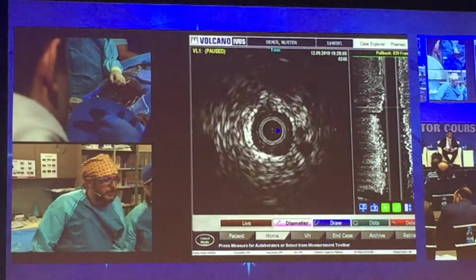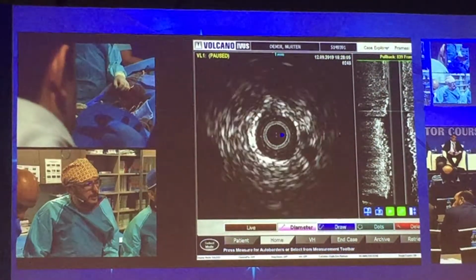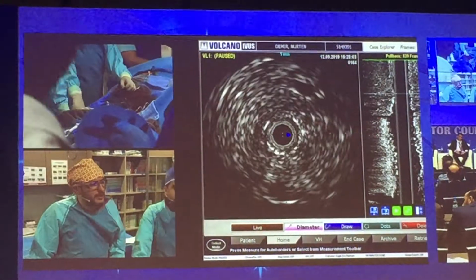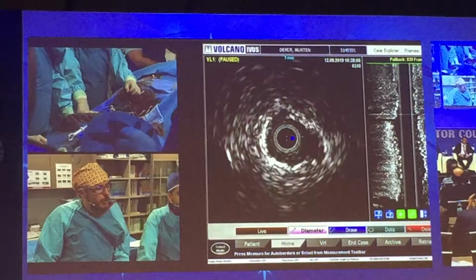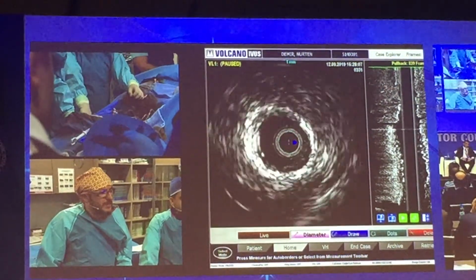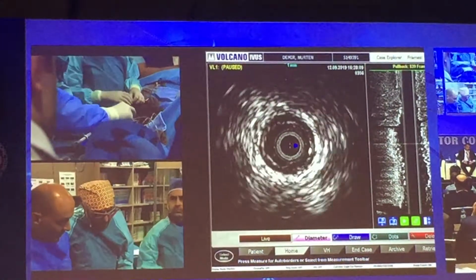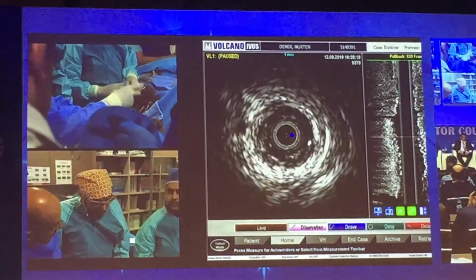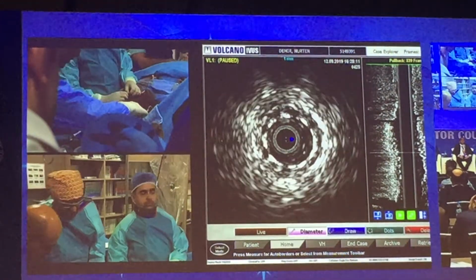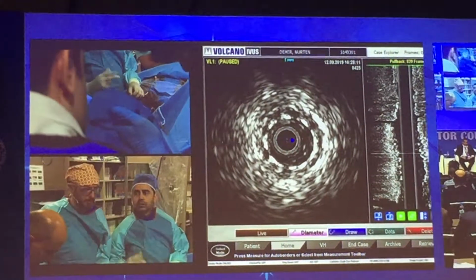Yeah, you are totally right, Kürşat. And the stent diameter is 3.5 to 5 millimeter. This is the vessel diameter, but the stent is underexpanded. You can see it very clearly on the IVUS. Yes, this point. Can you have some measurements from this point? You are totally inside the stent.